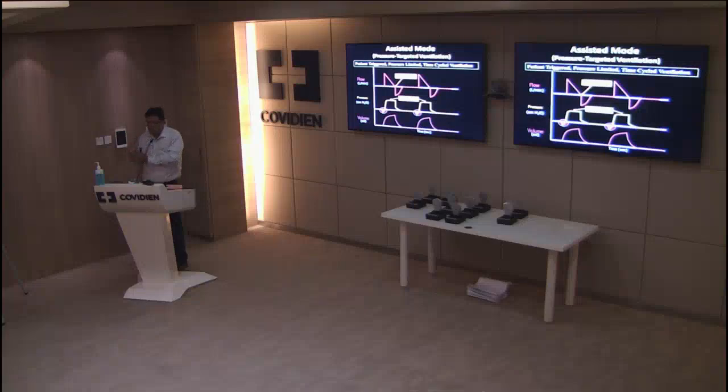So when you have set a rate of 20 and I ratio 1:2, it means the inspiratory time is 1 second. Because now if the patient breathes 30 times a minute, his inspiratory time is still going to remain 1 second. But expiratory time will now come down to 1 second also because each breath is 2 seconds. You understand? So now the I ratio is not 1:2, the I ratio is 1:1.